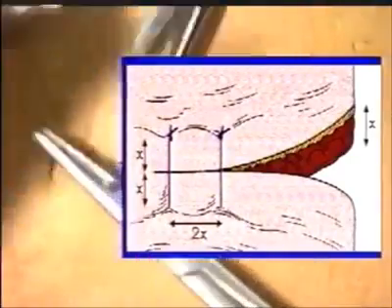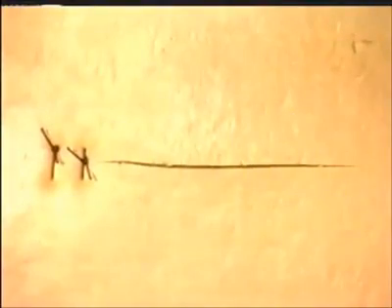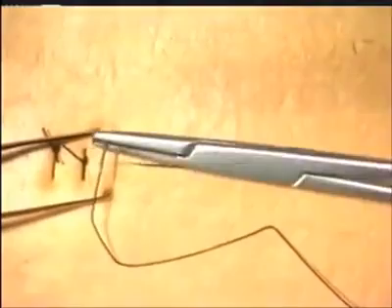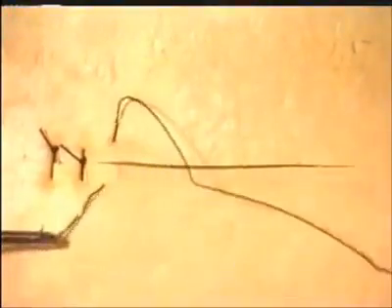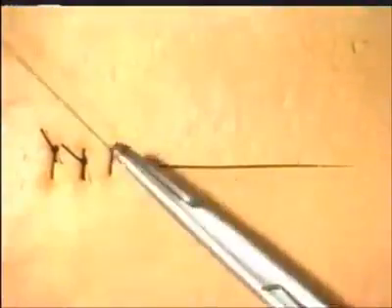Continue to insert your sutures in this manner across the entire wound. Now, let's insert another suture. When the incision edges are as closely aligned as these, it is appropriate to go through both edges with one smooth movement. But as will be demonstrated later, this is not always possible, and often the edges need to be taken separately.